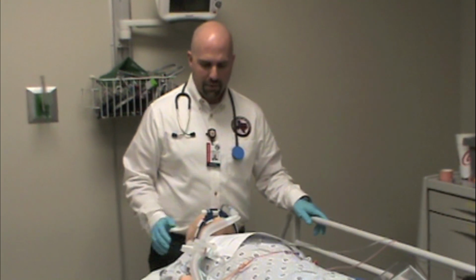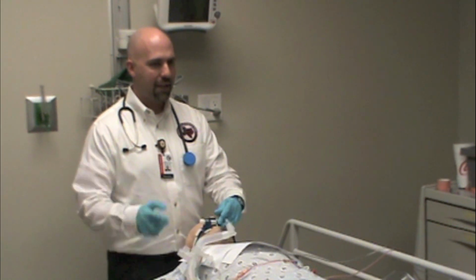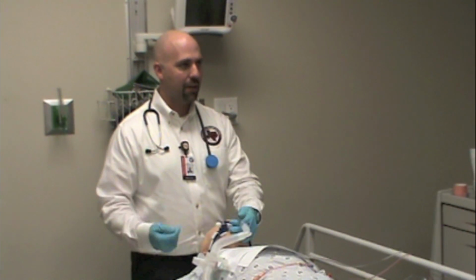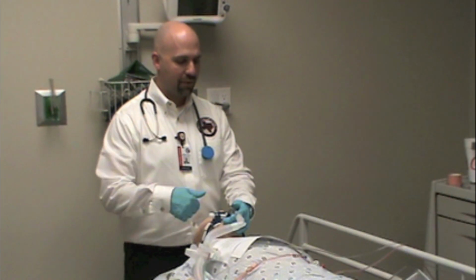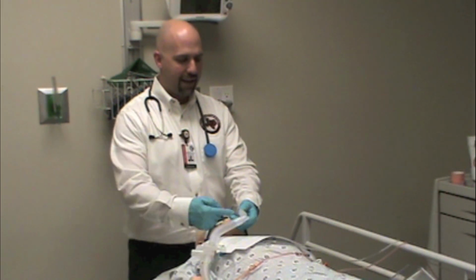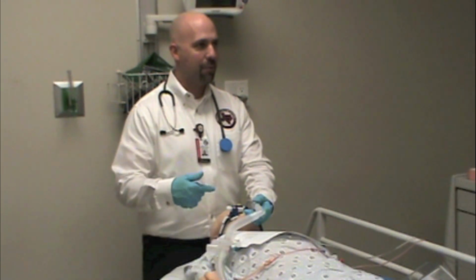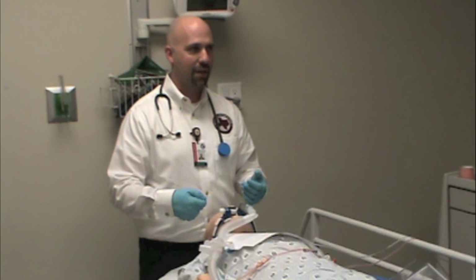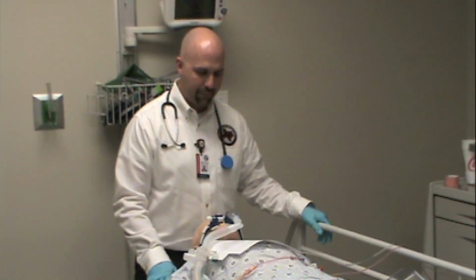O stands for obstruction. So if the patient's tube is kinked, you're going to get a pressure alarm. If they have secretions in the tube, they need to be suctioned, you're going to get a high pressure alarm. So you can use a soft suction catheter and suction the tube. If the sending hospital has an inline suction system already attached to the circuit, I would bring that with me so you don't have to break the circuit and put on sterile gloves to do tracheal suctioning. Just a whole lot easier to use the inline circuit if that's available.